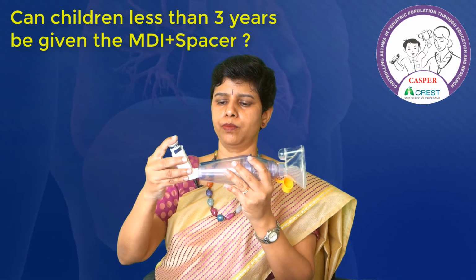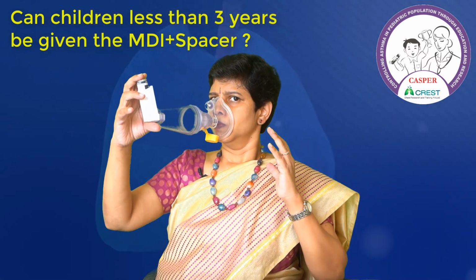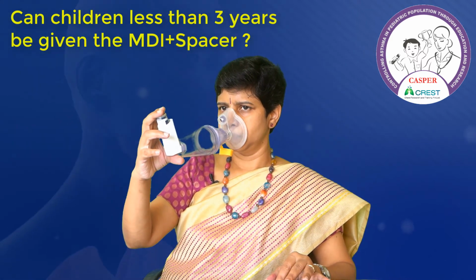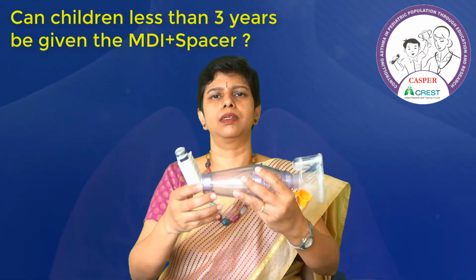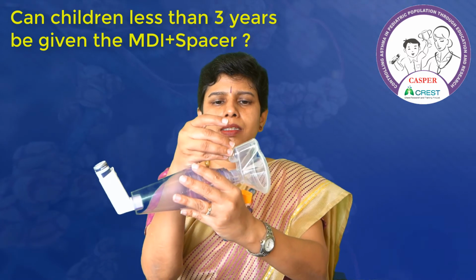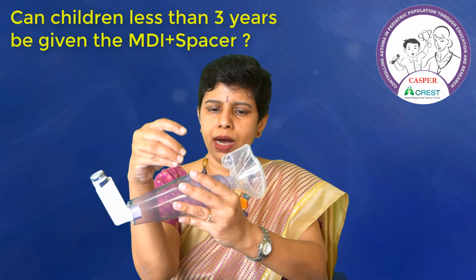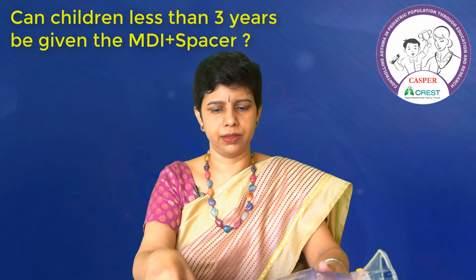Okay, I'll just demonstrate. So all that the child has to do is just allow the mask to be here and breathe in and out of the mask. There's a one-way valve to the baby mask as well, where the exhalation will open up the valve and allow the air to go out. So this becomes a very useful device for children less than 3 years.